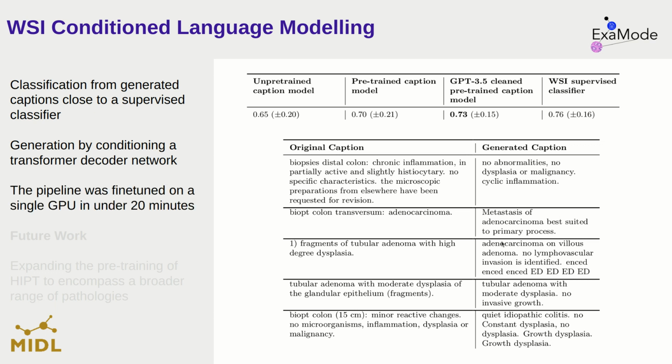Because we use pre-trained transformers and only train each time on the resulting embeddings, we could bring the training of the whole pipeline under 20 minutes on just one A100 without too much code optimizations.